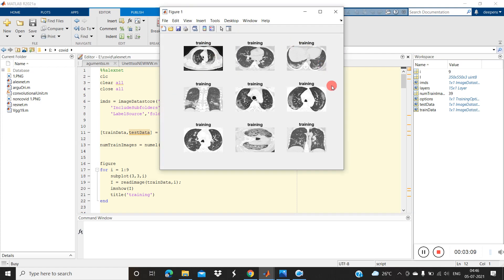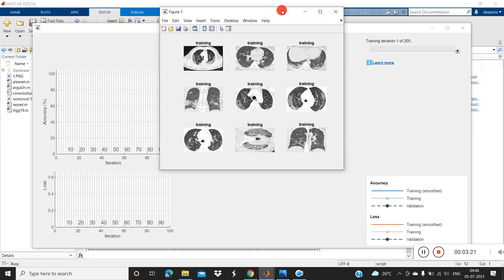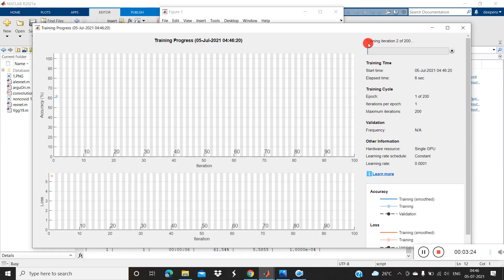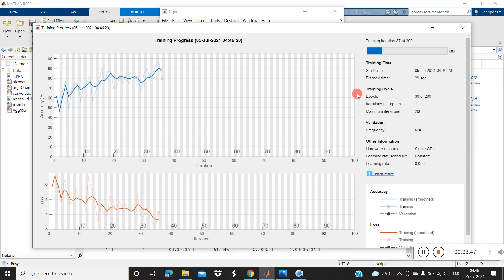These are the training samples taken for training. Here you can see the COVID and non-COVID images. Now the training has started. We can see the loss values and accuracy updating. We have set the maximum iterations to 200 and it's currently running — it will take a little time.